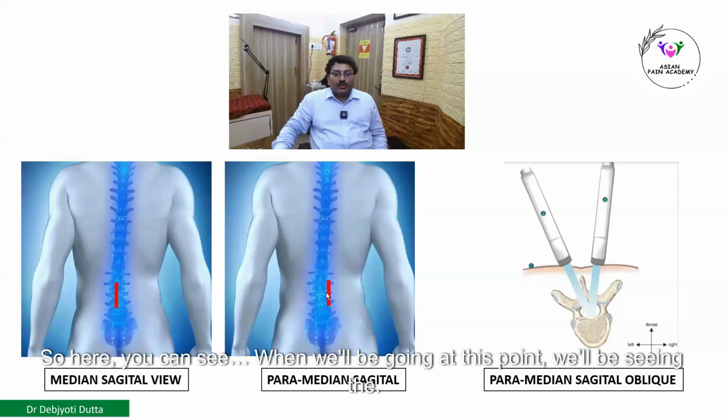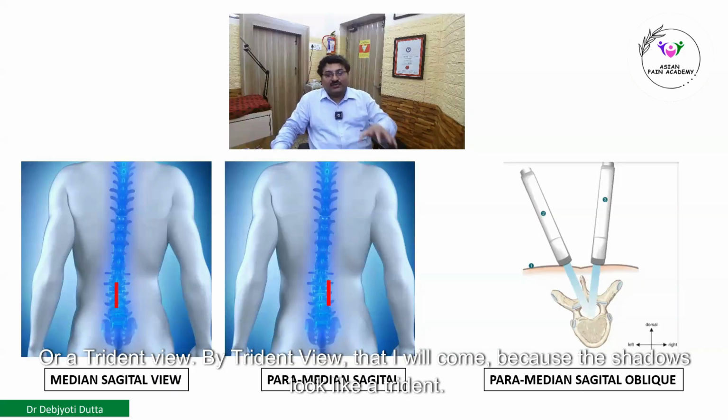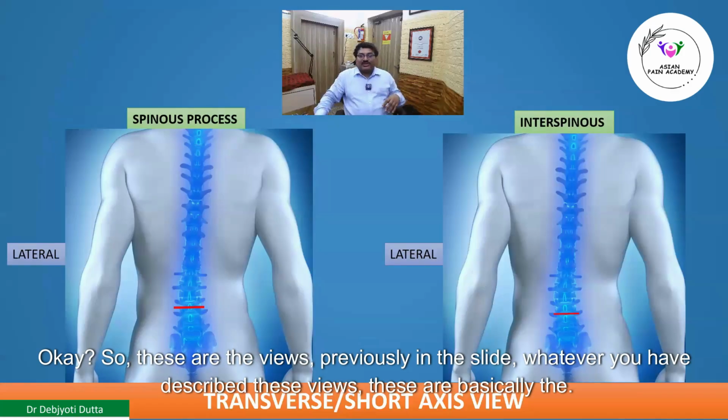Here you can see when we go to this point, we'll be seeing the camel hump view. And if you go further, then there will be only the projecting transverse processes. So it will be the transverse process view, or we also call it finger-like projections or a trident view. Why trident view? I will come to that, because the shadows look like a trident.